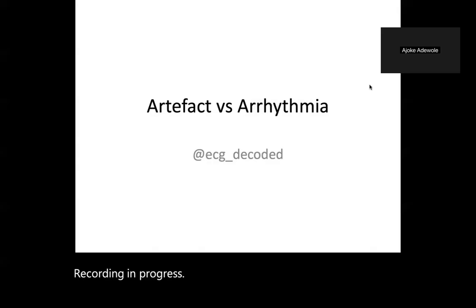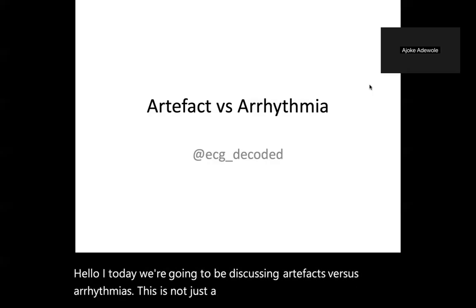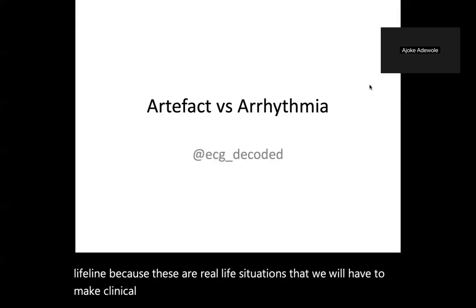Hello. Today we're going to be discussing artifacts versus arrhythmias. This is not just a presentation. I consider it a lifeline because these are real life situations that we will have to make clinical decisions on. This can save lives. It can also stop panic before it starts.